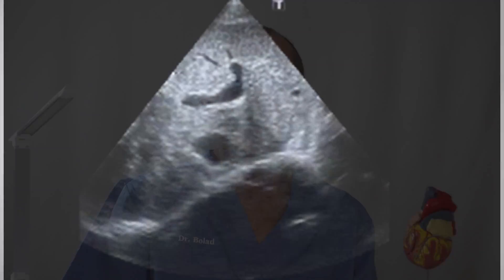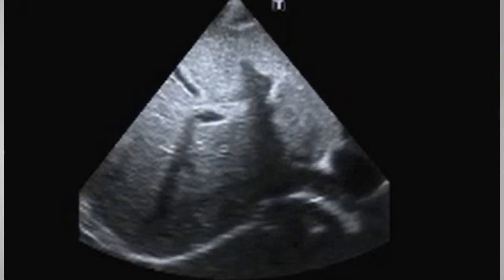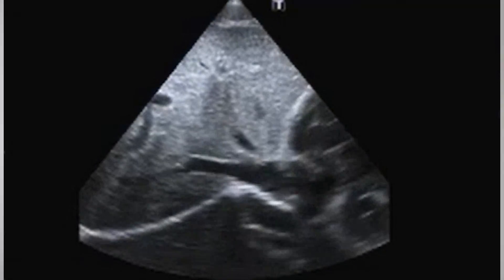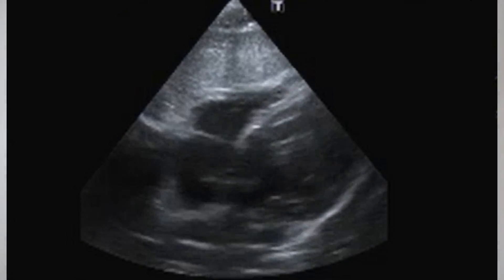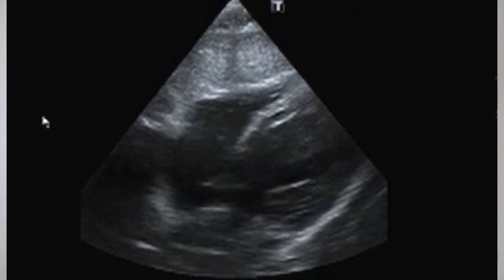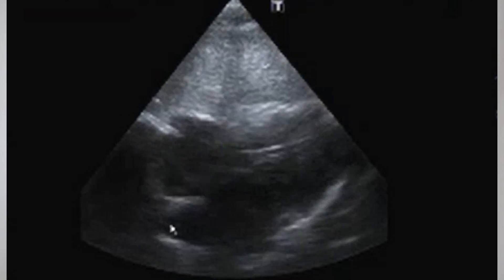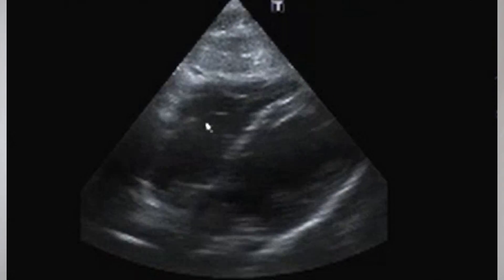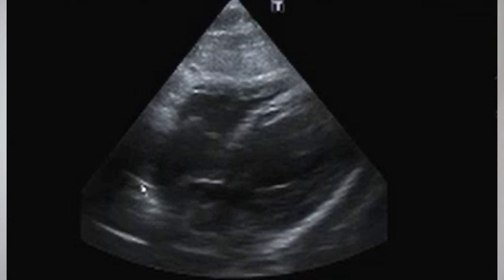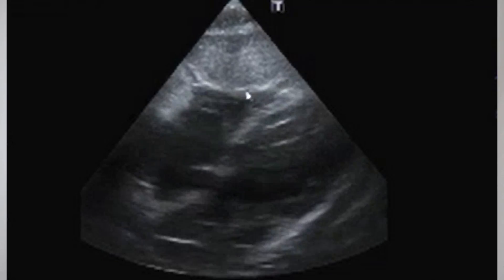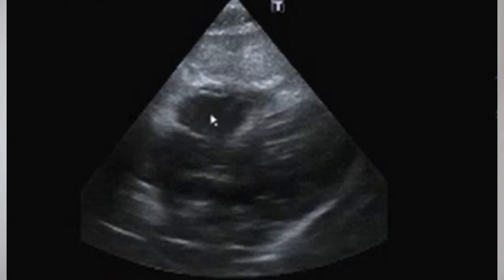From here I move my probe to the lower part of the chest and perform the subcostal views. I first get a view of the inferior vena cava to assess whether it is dilated or not. I then tilt my probe to view the heart from this subcostal position, where you can see the interatrial septum, the tricuspid valve, the right atrium, the right ventricle, the left ventricle, and the left atrium.